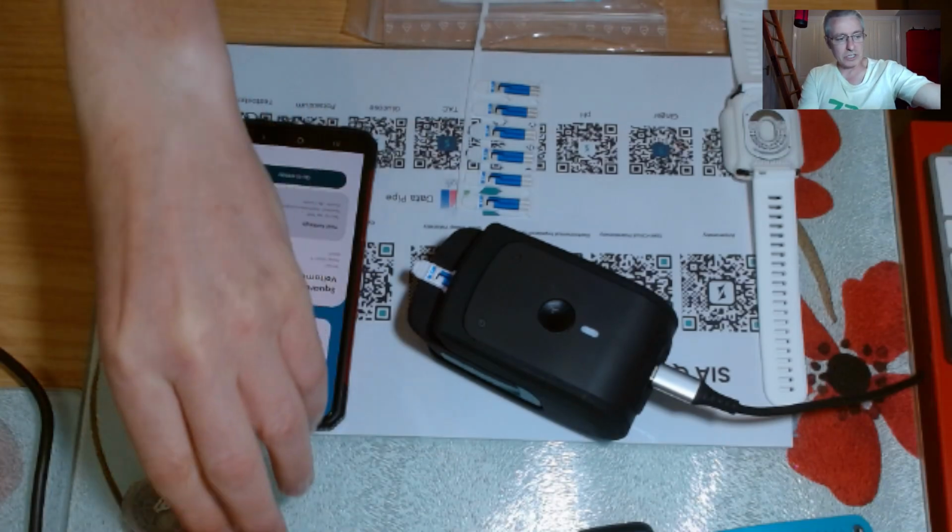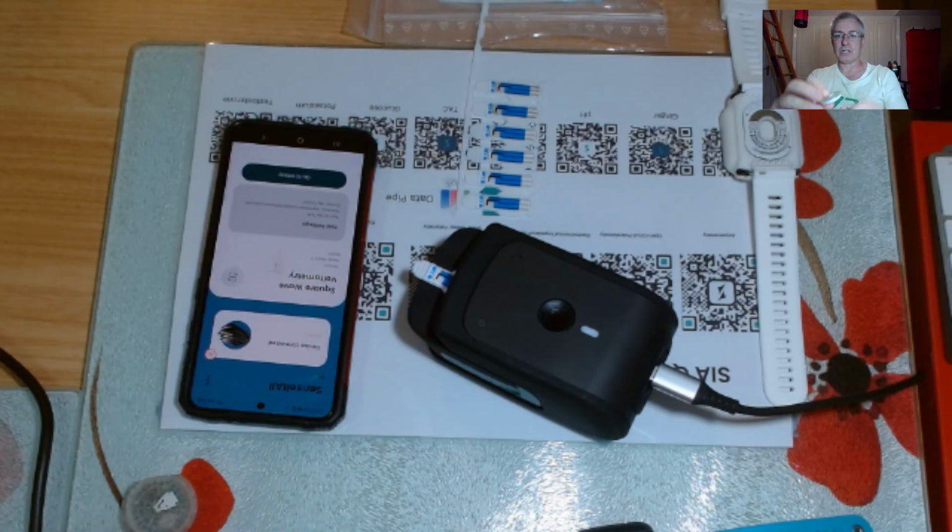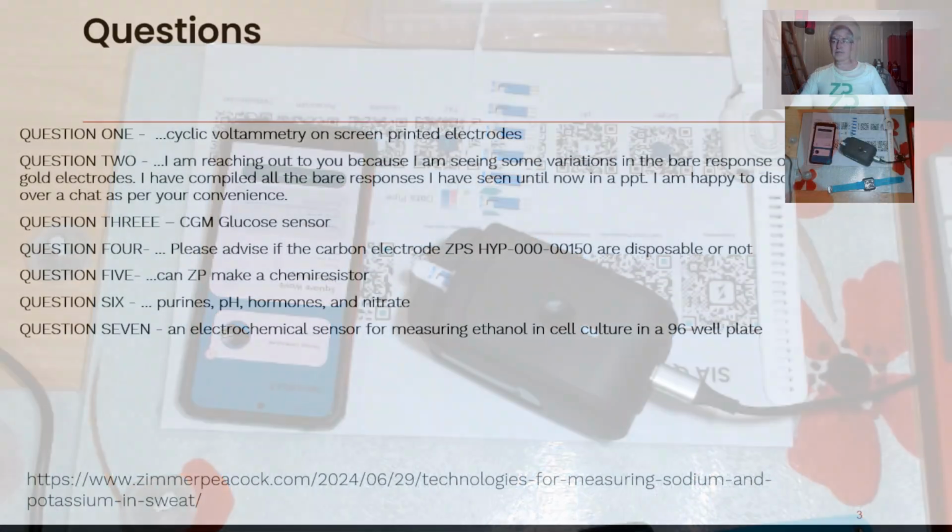Anyone who works on CGM, continuous glucose monitoring, this is an example of CGM. In fact, I realize I have to share my screen in a minute to show you the question, but something like this is the Abbott Freestyle Libre 2. They will suffer from biofouling. So biofouling in biological systems is not unusual, and we see it across several applications.